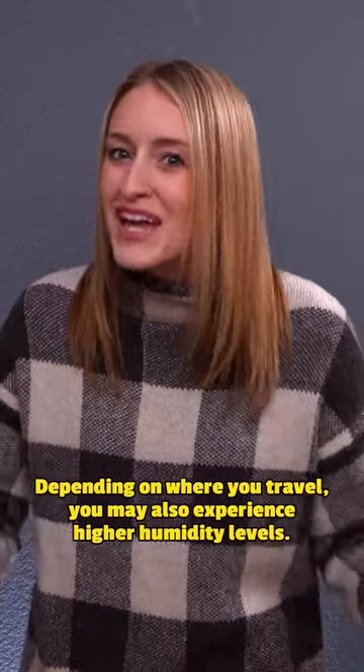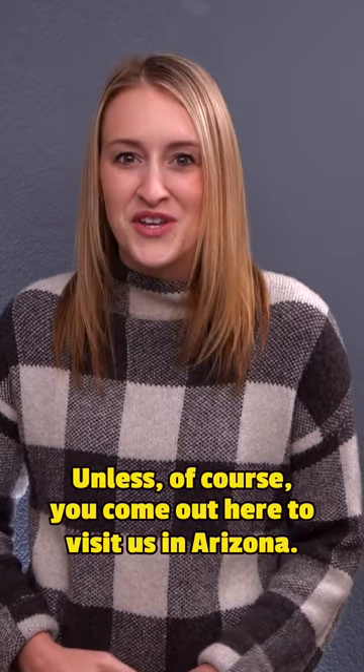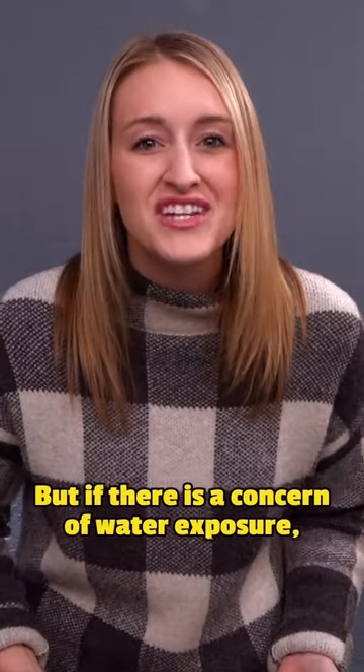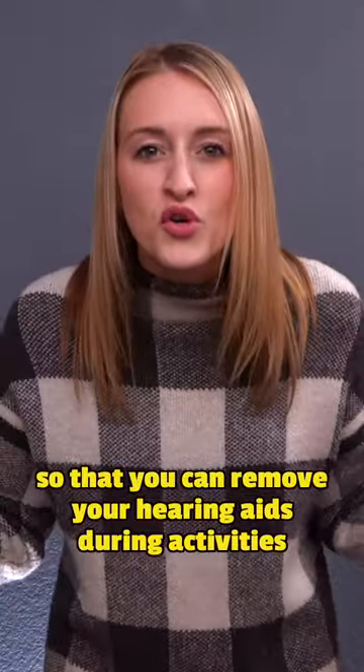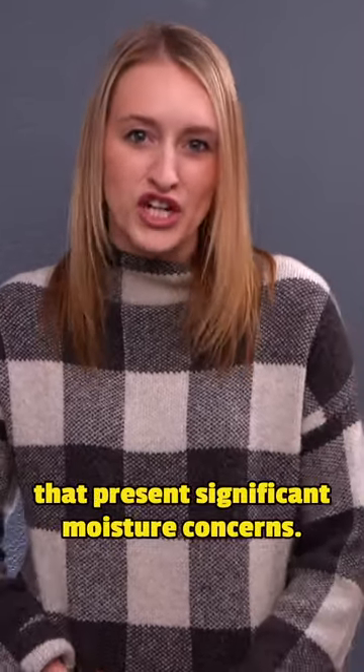Depending on where you travel, you may also experience higher humidity levels — unless, of course, you come out here to visit us in Arizona. But if there is a concern of water exposure, make sure you pack a carrying case so that you can remove your hearing aids during activities that present significant moisture concerns.